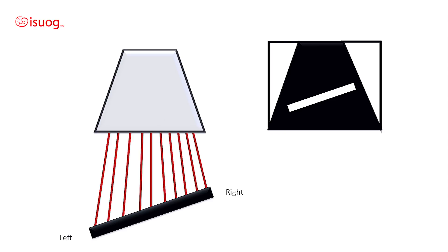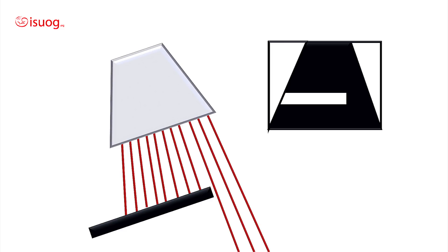Once you dip on the narrow aspect of the probe, the surface of the probe becomes parallel to the femur. Therefore, the femur will appear in a horizontal view on the screen. However, the left end of the femur will become outside the range of the ultrasound wave. To bring the femur to the center of the screen, you will need to slide on the narrow aspect of the probe. Please note that while sliding, you need to maintain your dipping.